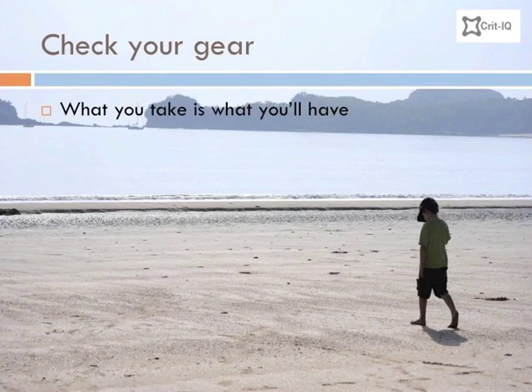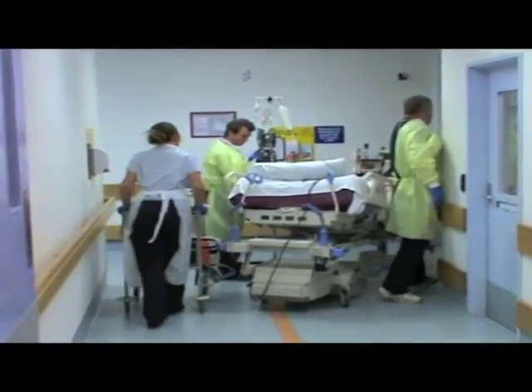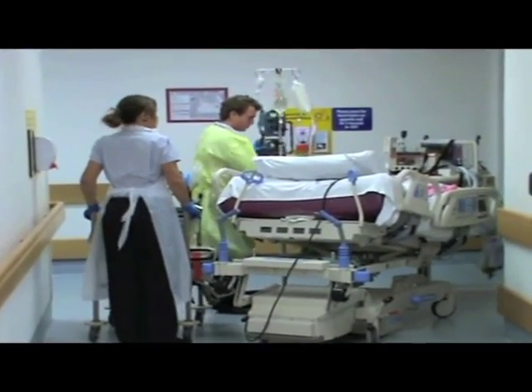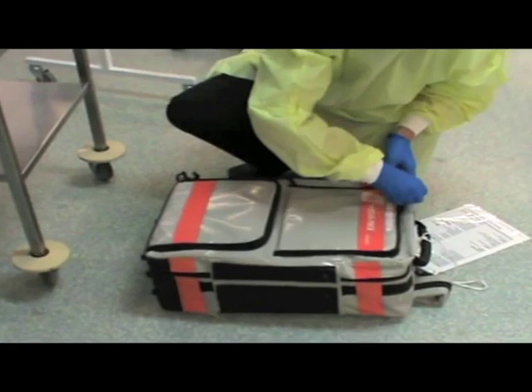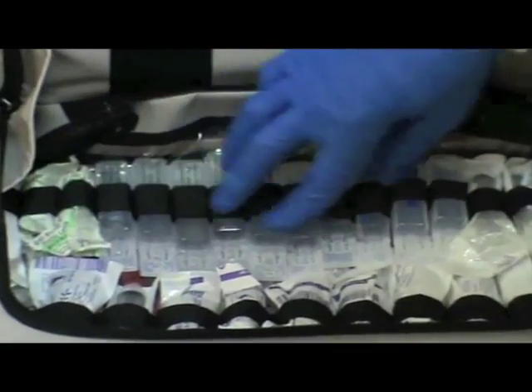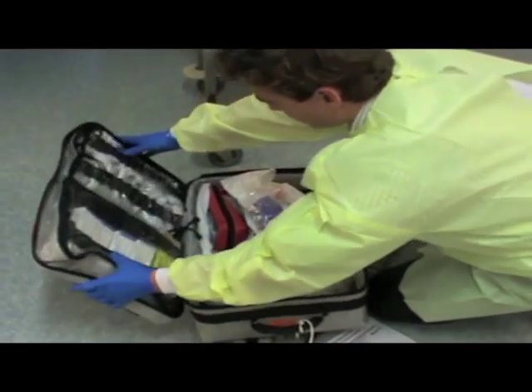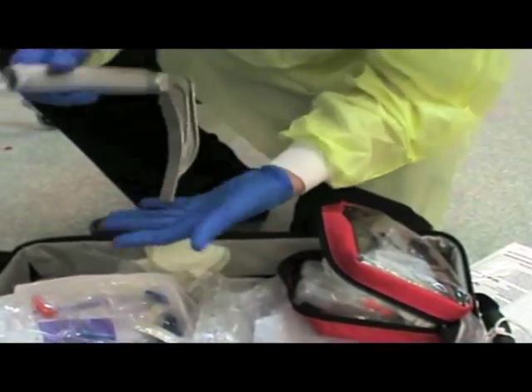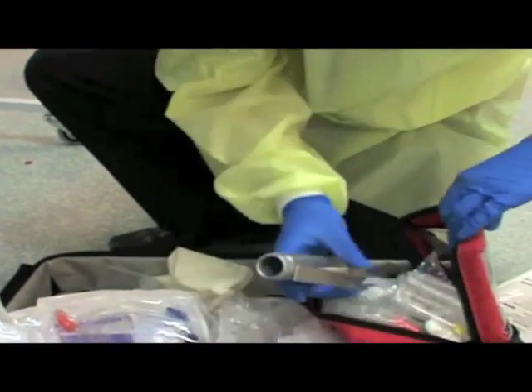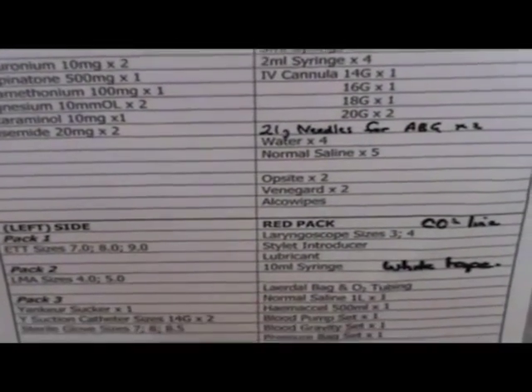Remember, you will need to take anything with you that you'll need to deal with the patient. You should work on the principle that once you've left, that's all you will have. Most hospitals will have some sort of kit to take with you that has the equipment and drugs you will require. Ensure that you know what is in these packs, where the items are located, and that they are still serviceable. Other units have developed checklists for preparation that include mandatory equipment lists.